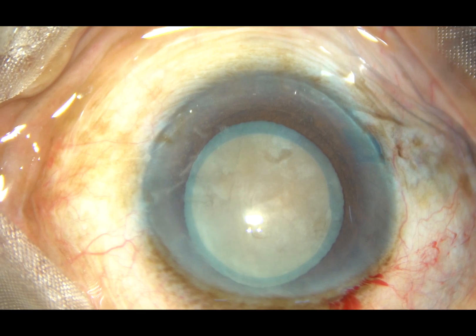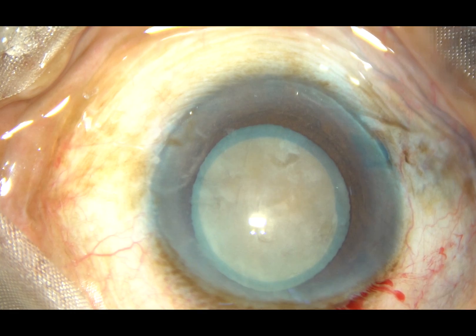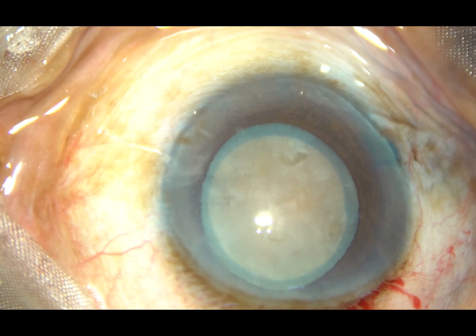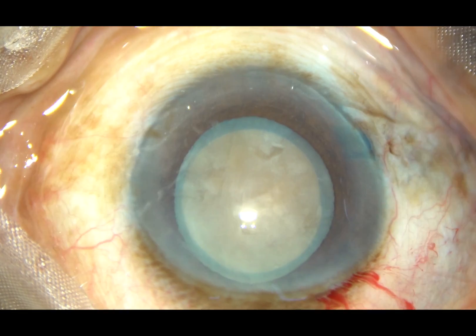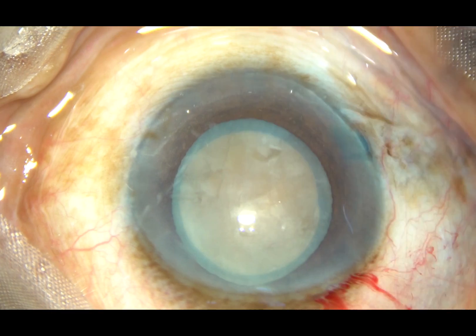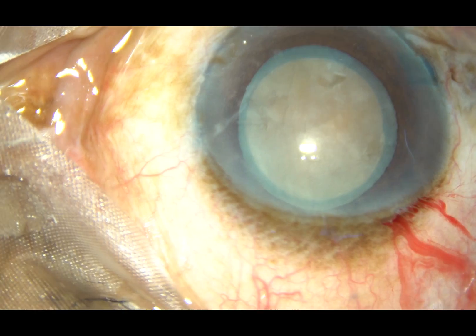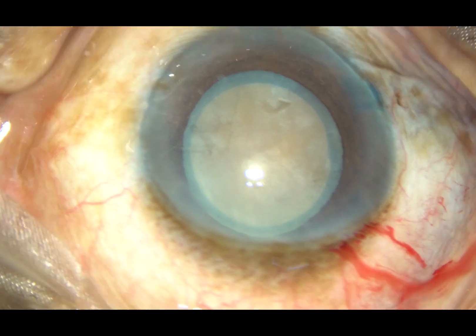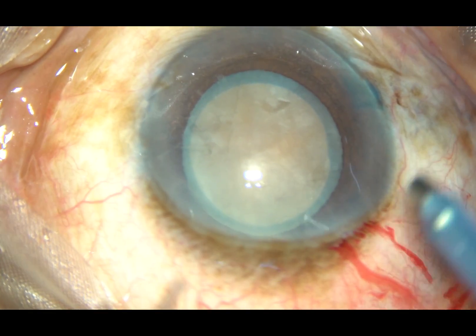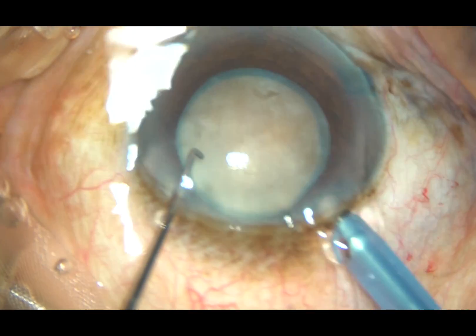Viscoelastic is injected again, and now is the time to introduce the tip of the phaco handpiece. The machine being used is the Oertly Catarex 3. It's a beautiful machine. And here it is. The tip goes in first, beveled down. This is a totally unedited surgery.